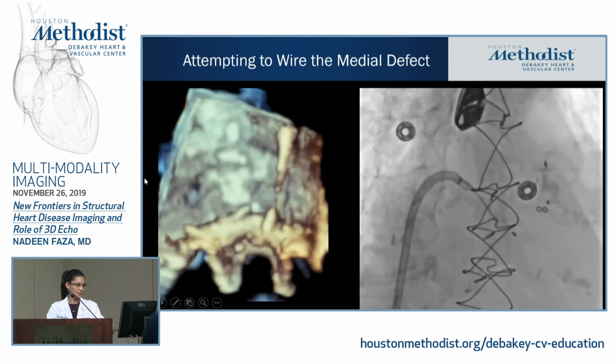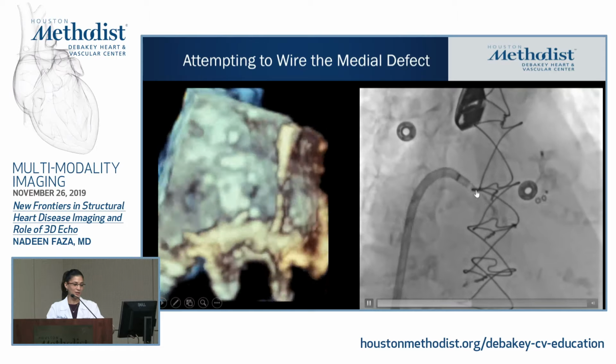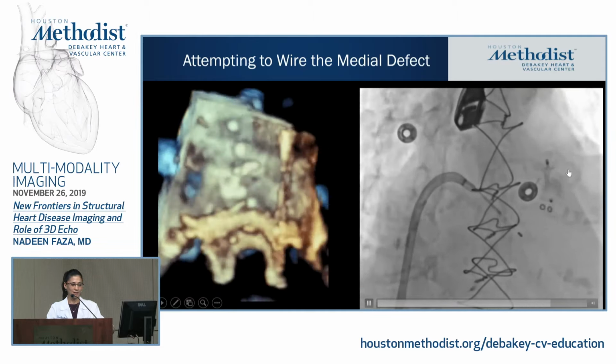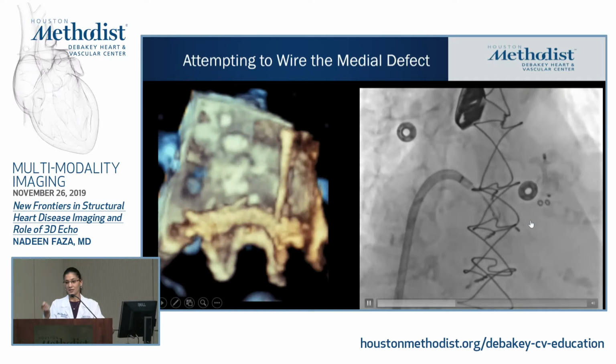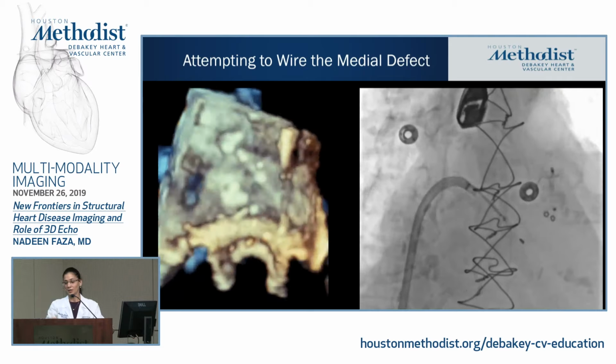So this is their lateral defect. This is the medial defect. And you can see that we're trying to wire the defect. This is the deployed plug in the lateral defect, and we're unable to pass the wire through it. Again, these defects are small and have tortuous courses, and sometimes it's really hard to pass a wire through them.